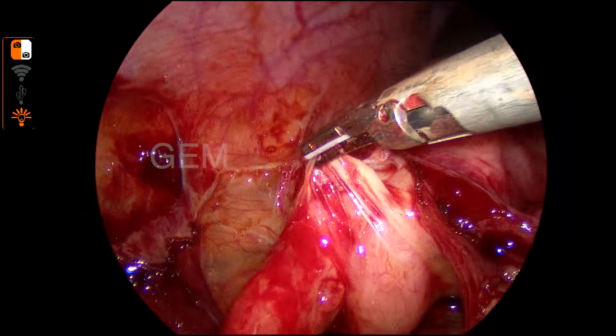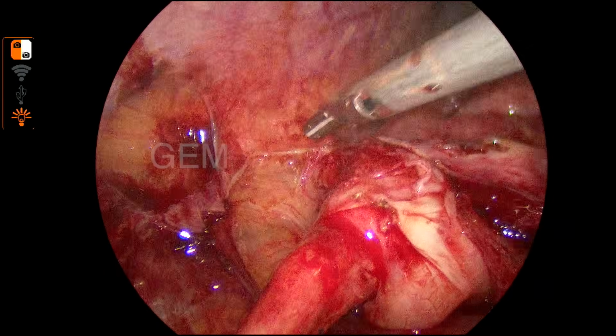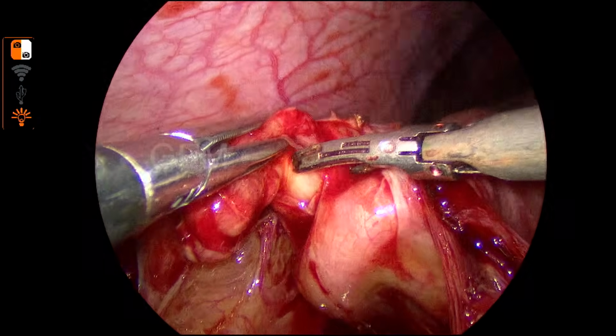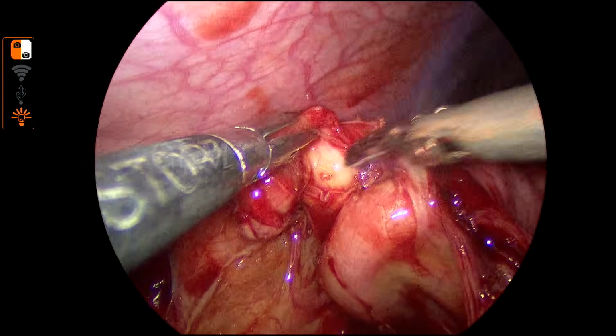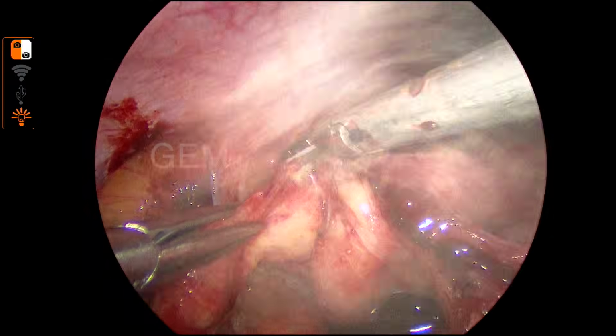See, now I'm trying to separate the adhesions. I'm trying to straighten the appendix. It's not adhesions, basically straighten the appendix between the two bent surfaces.